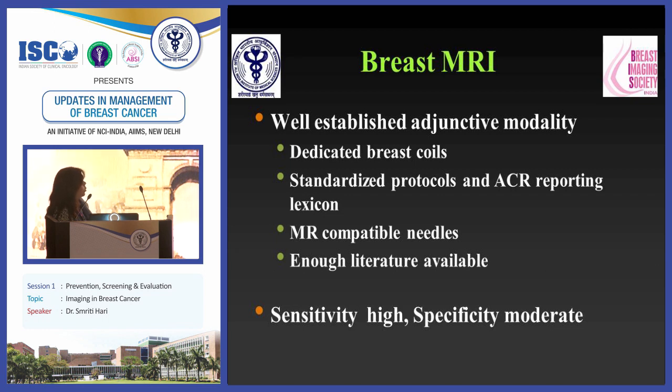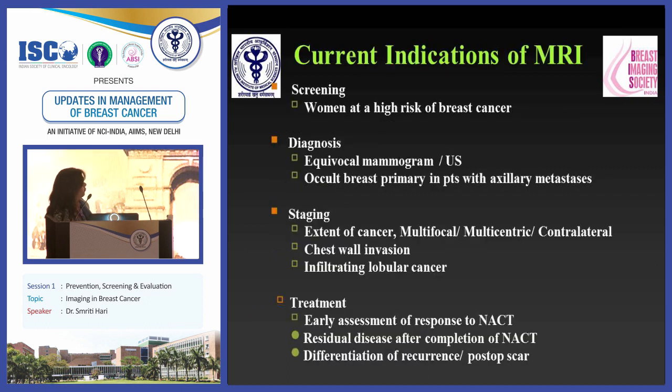Breast MRI is now very well established because of the standardized protocols that we use, because of the dedicated breast coils we use, and now there is enough literature available on its value. The sensitivity is very high, but we must remember the specificity is moderate. So there are a whole lot of current indications of MRI, some very well established, some controversial.